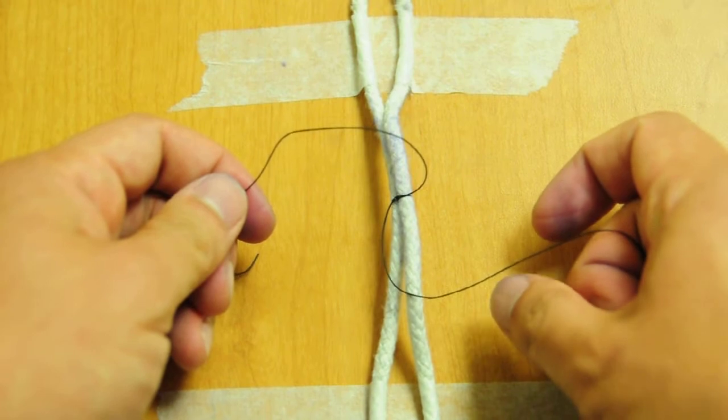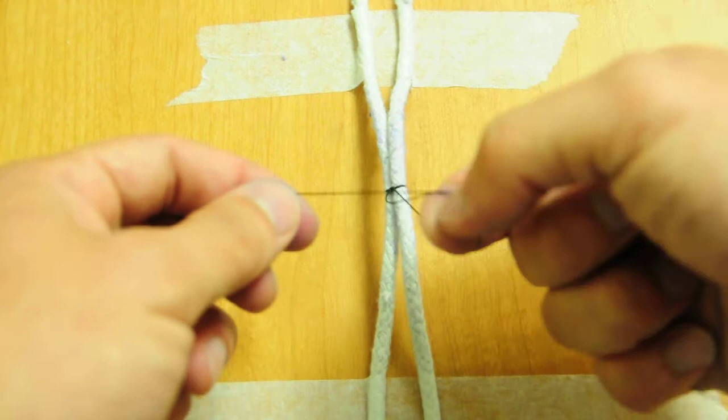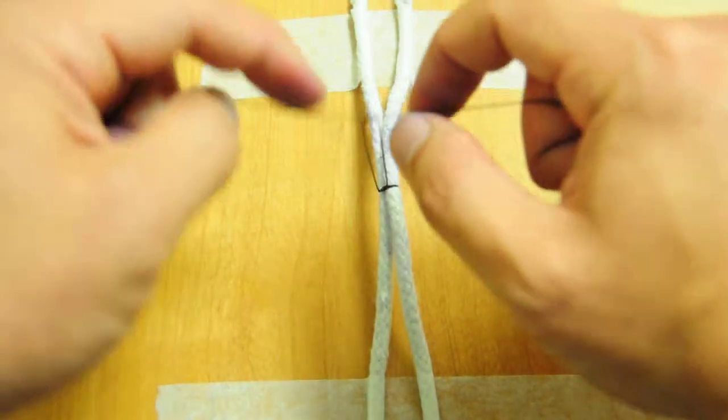Then, now I'm going to do the index finger, go back to the thumb, make a loop over the thumb, come to the other side of your loop, grab the loose end, push it through, and cinch it down.